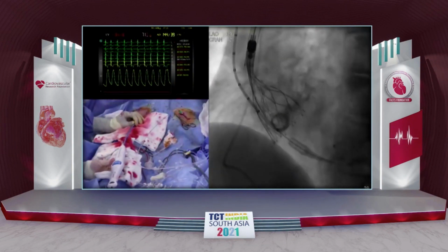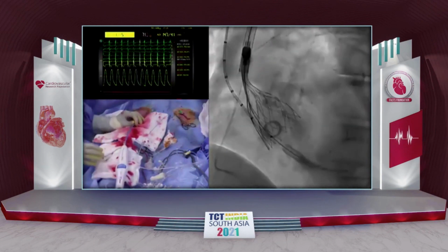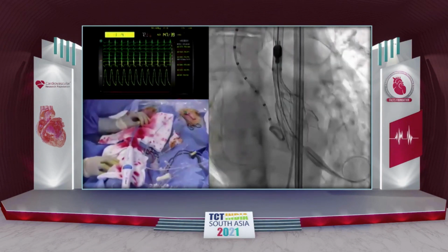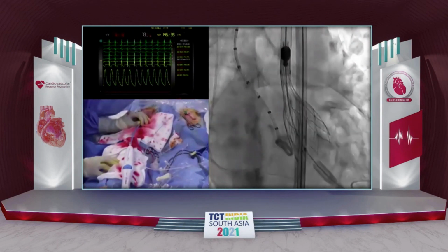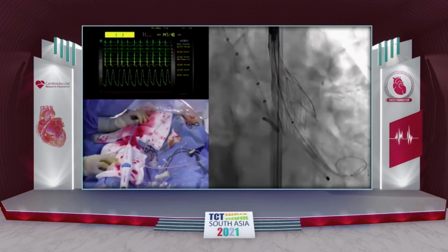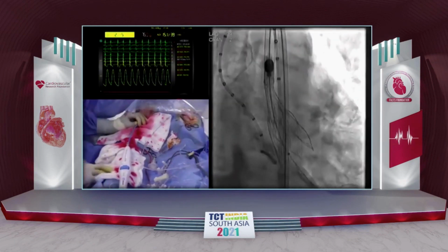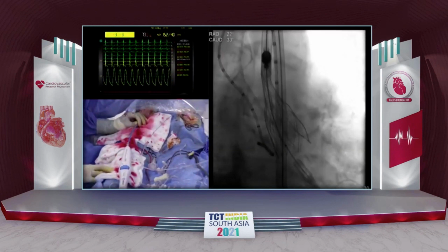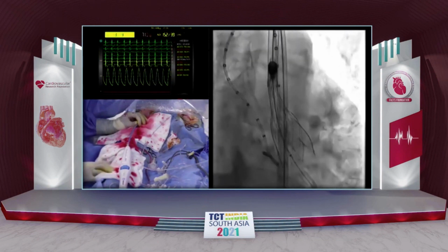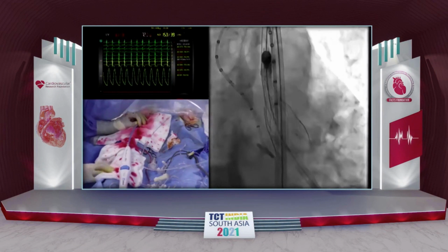Now, we have about 15 minutes, so we have plenty of time. We're going to go to the cusp overlay angulation now. So I'm going to fluoro this while we do that. Okay, coupling off. You can see that the frame is still not fully aligned, so I'm going to go a bit more caudal, without losing my finger. Okay, perfect. Coupling on now.